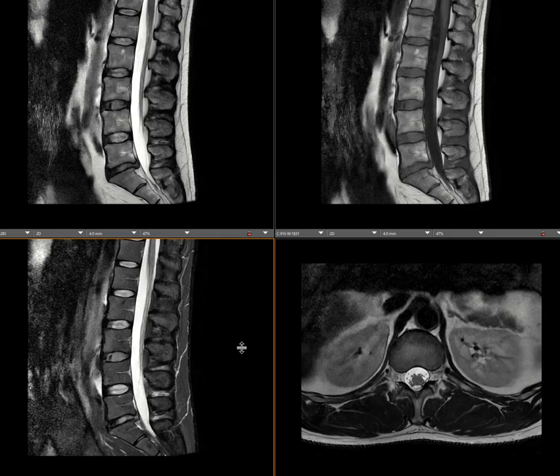It also occurs in teenagers, who might have some back pain because some kids are very active and do a sport, so they're going to have a lumbar spine MRI due to back pain. That age group has different entities and different reasons, but this specific talk is going to be about older people, 40 and above, who have degenerative disease, and that's the cause of back pain.